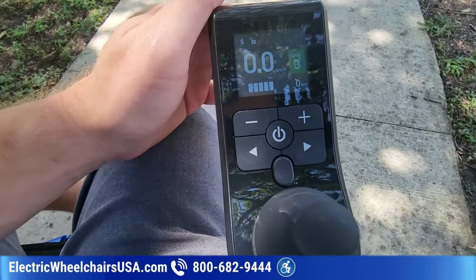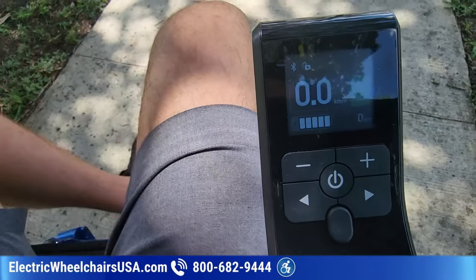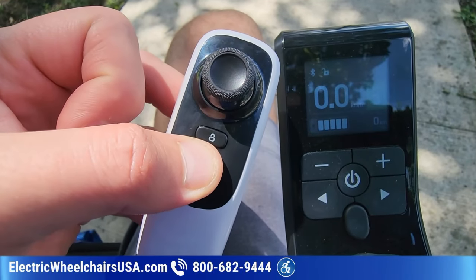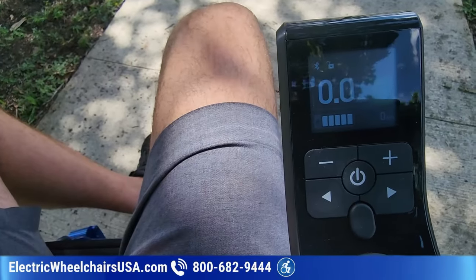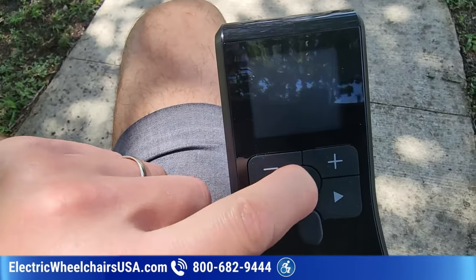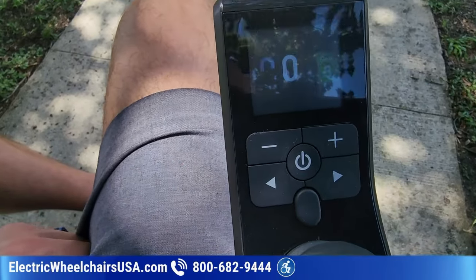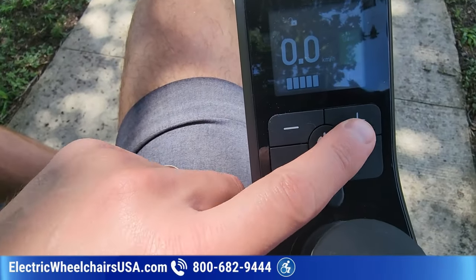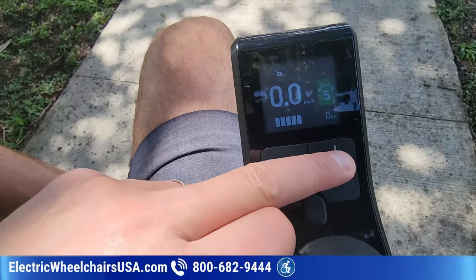Now, as far as some other buttons on here, you can see the Bluetooth symbol shows it's still paired with the remote control. I'm going to turn this off. Actually, what I'm going to do is just power it off, and I'll power it back on so it's not paired anymore. All right, so obviously this is the power button. Here's how you control the speed control. Get it up to that 5 position.